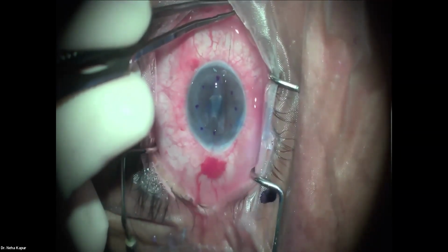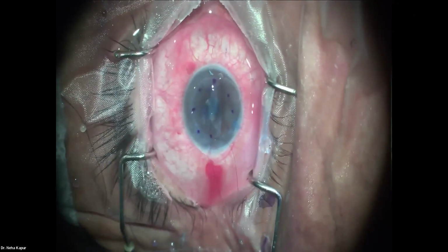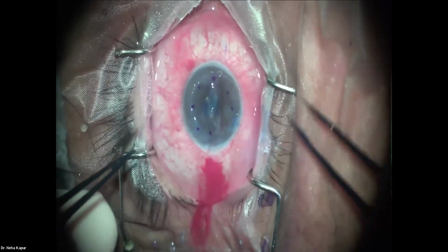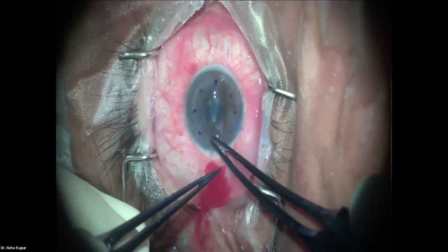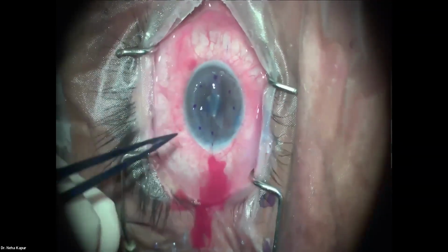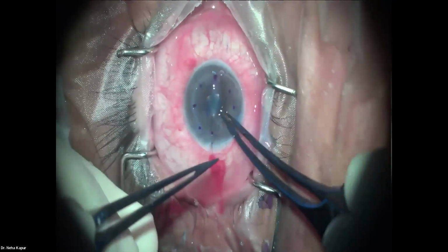We at no point like blood inside the eye during the surgery. It will make view difficult and inhibit adherence of the graft. Just one suture to close the incision so that your tissue is secure in the eye.